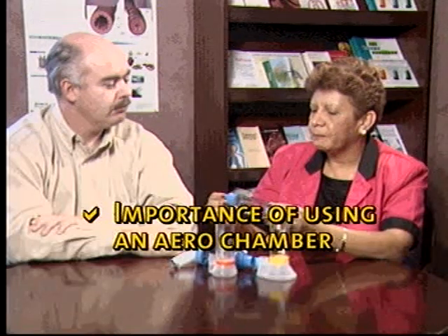The importance of using an aero chamber. Many people use the inhaler without the aero chamber. The way they do it is to shake it very well, but they put it inside the mouth. Now, the distance between the lips and the back of the mouth is almost this much, okay? So if I do this, the medication is going to go too fast. Everything is going to hit the back of the mouth, the person is going to swallow, and the medication goes to the stomach. In that way, the person can have too many side effects, and the medication doesn't go to the lungs, where it is supposed to be.